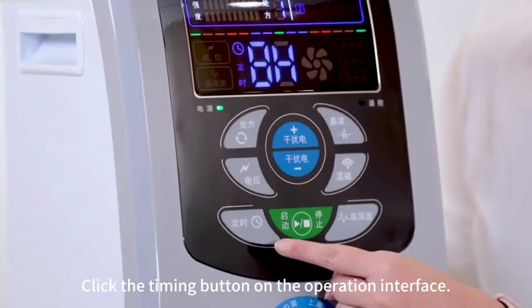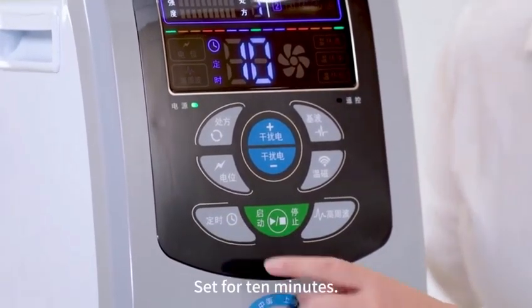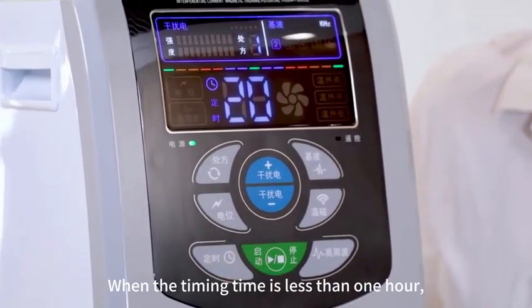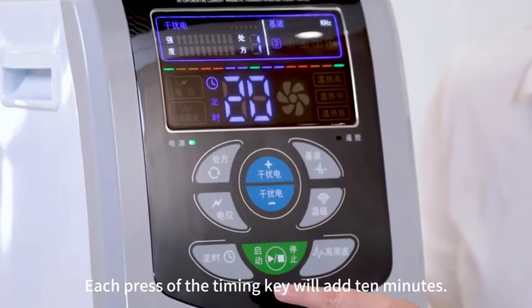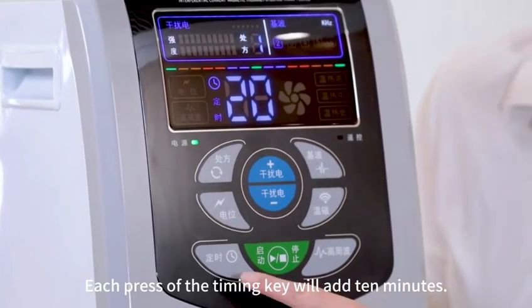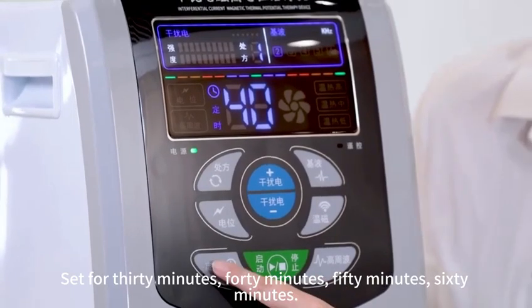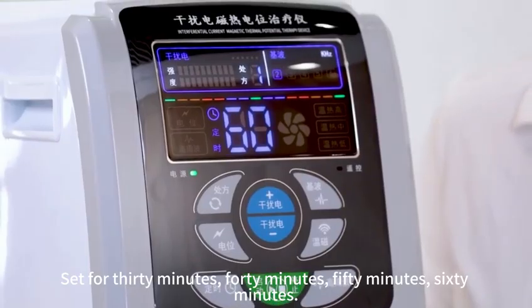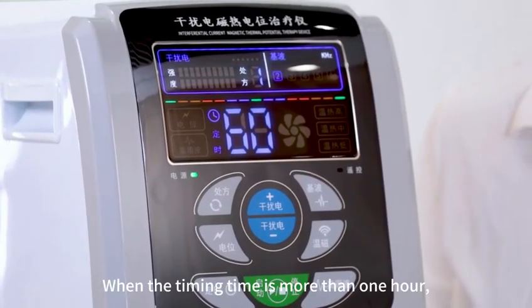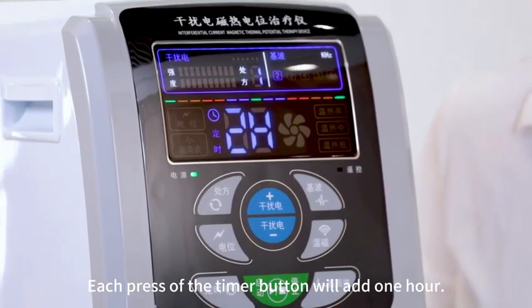Click the timing button on the operation interface. Set for 10 minutes. When the timing time is less than 1 hour, each press of the timing key will add 10 minutes. Set for 30 minutes, 40 minutes, 50 minutes, 60 minutes. When the timing time is more than 1 hour, each press of the timer button will add 1 hour.